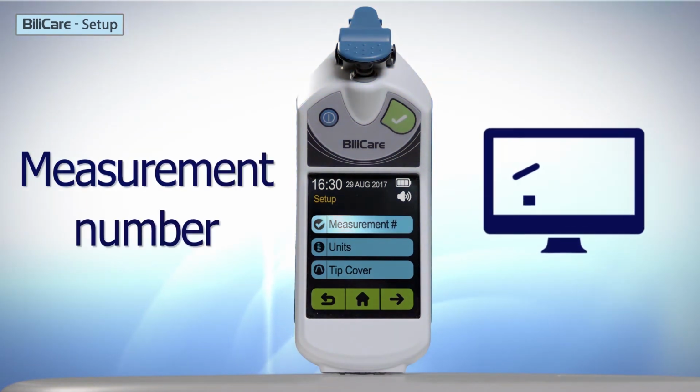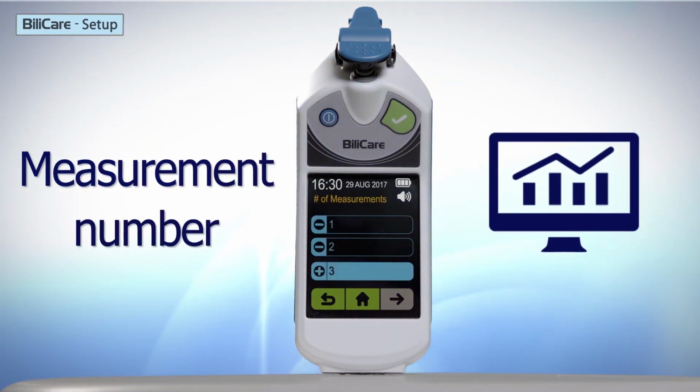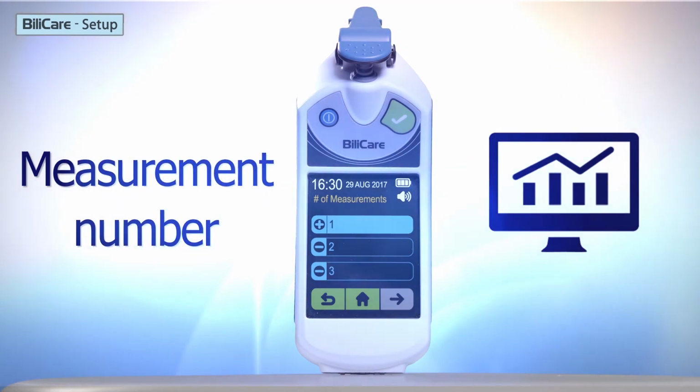Measurement number. BiliCare may conduct a single, double, or triple measurement before displaying the bilirubin result. The result displayed is an average of the different measurements taken. The default is a single measurement.